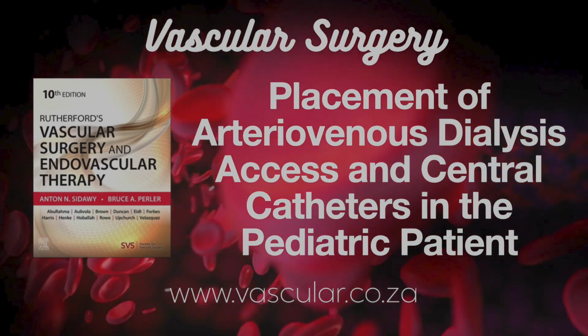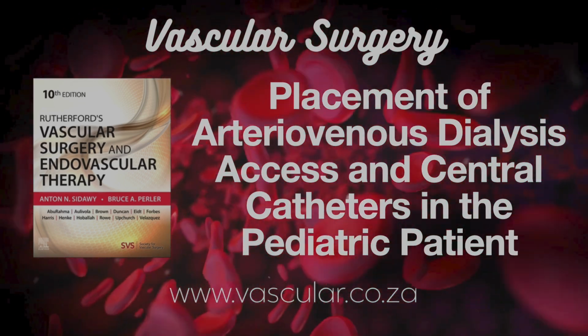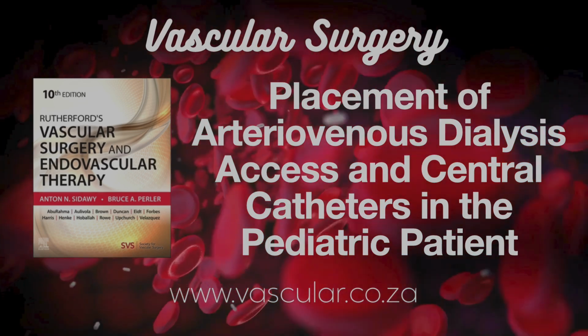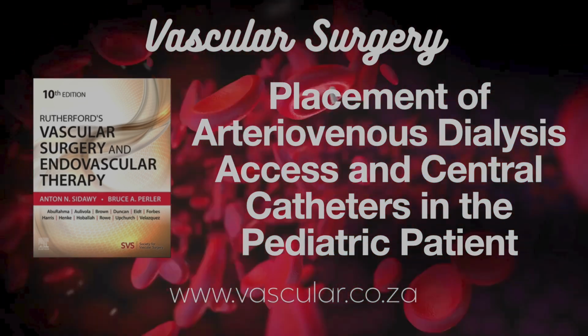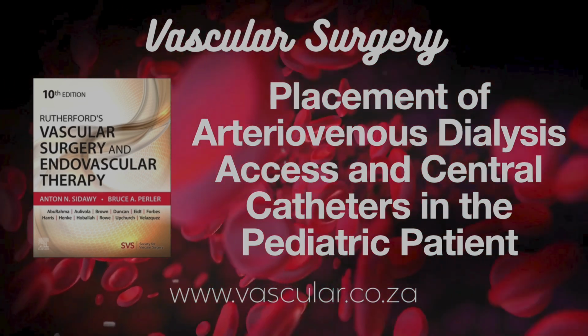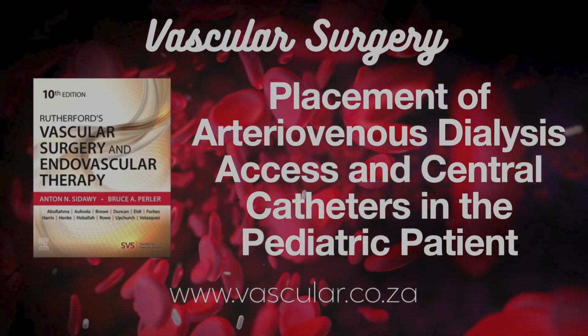KDOQI has a preferred order for veins. Right internal jugular first. Avoid subclavian if possible to try and minimize this. Does having a catheter on one side mess up putting a fistula there later? Interestingly, in kids, it seems like having an ipsilateral catheter, same side, doesn't really hurt the long-term success of a future fistula. That's different from what's often seen in adults.